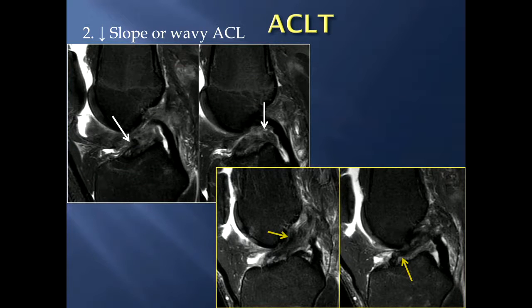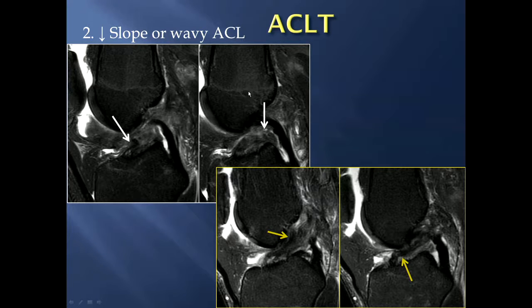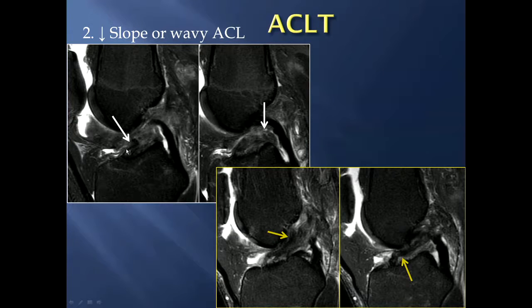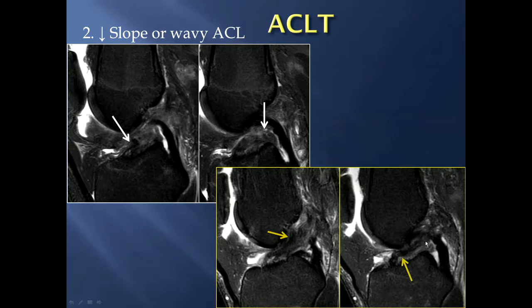The second sign is where the entire ACL has a decreased slope or a wavy appearance. Typically, to look at the entire ACL, you want to look at two consecutive images that go through it. On this one you've got a decreased slope of the ACL, and on this one a wavy appearance on both images through the entire ACL — both are complete ACL tears.